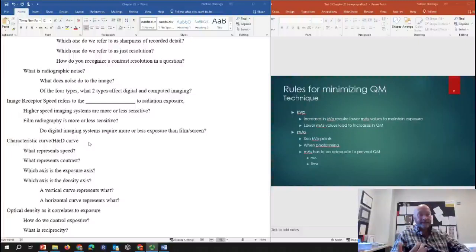So if you've seen two of those images, and you probably have, you just aren't real sure, you hadn't put it together yet, maybe. So the higher contrast images, especially in the abdomen, generally come from asthenic or at least sthenic patients. The real gray, washed out looking ones are generally your hypersthenic patients.